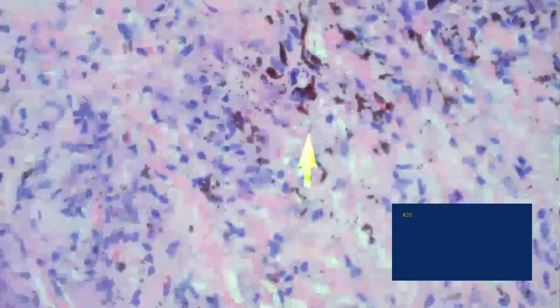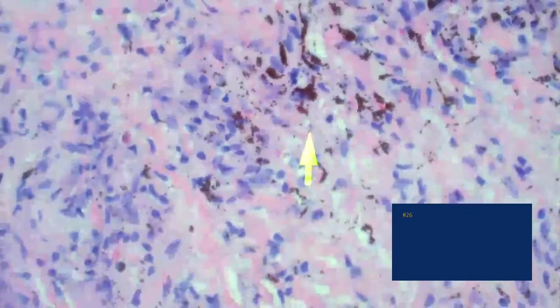Is this normal material here? No. What is that? So there is some darker material. It's very dark. It's very brownish. When we see that color, we think of melanin. You could think of melanin, but it's not jet black, is it? Getting higher magnification, it looks like it's particles. Particulate. It's slightly refractile. It's not perfectly refractile.